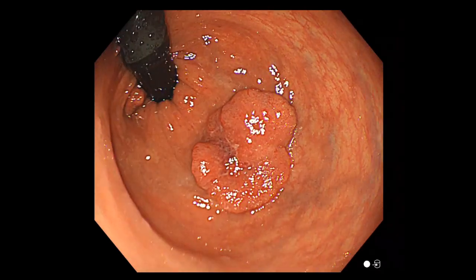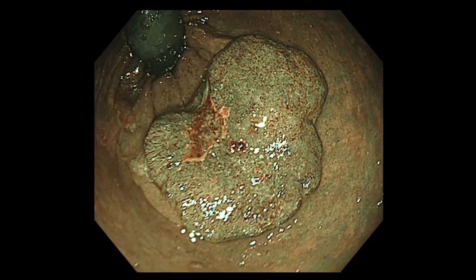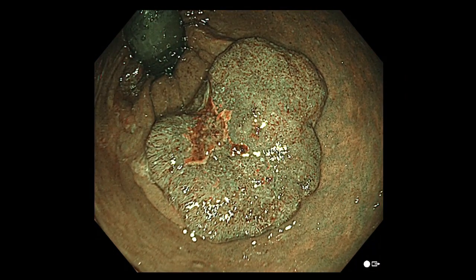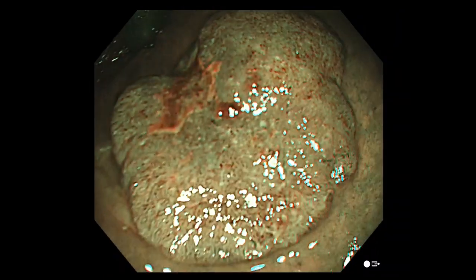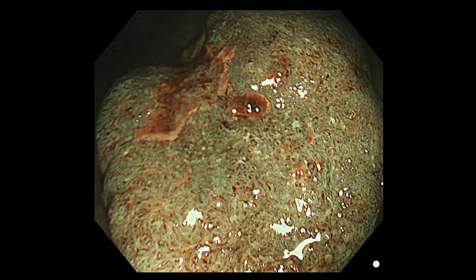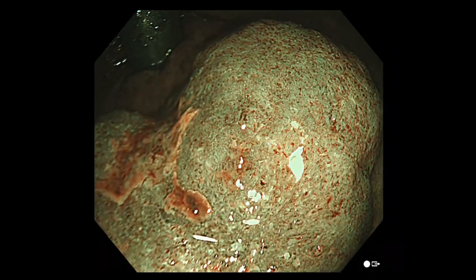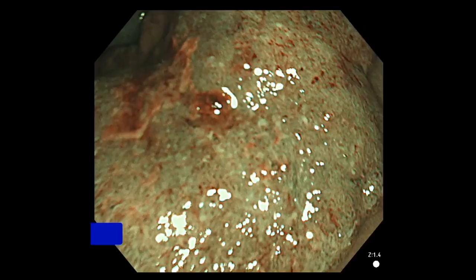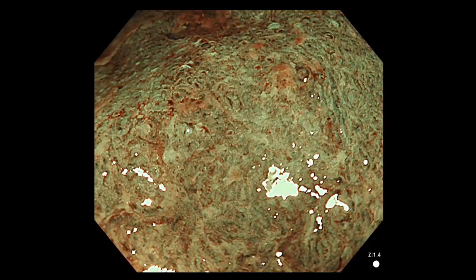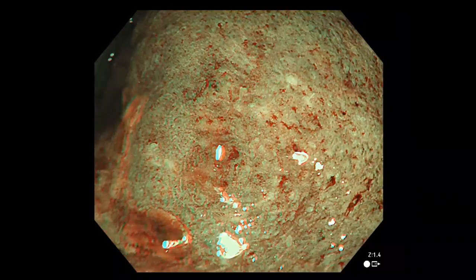This is a case in the rectum, and the diameter of this lesion is approximately 40 mm. The tumour has a large, thickened, depressed area. This lesion has loose vessel areas and some thick vessels are interrupted. The structure of the surface is destroyed and amorphous. These features are typical for JNET type 3.